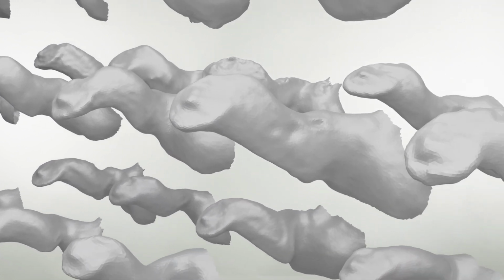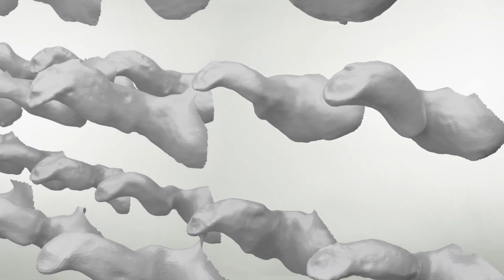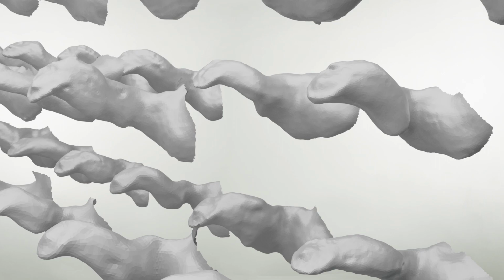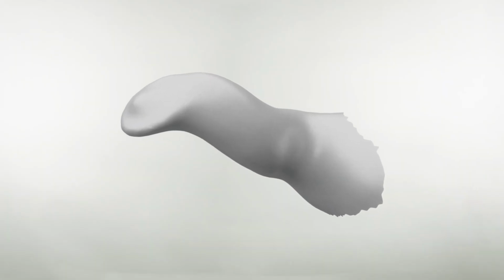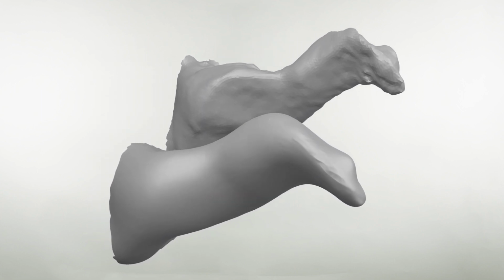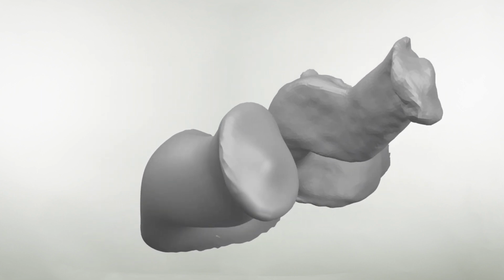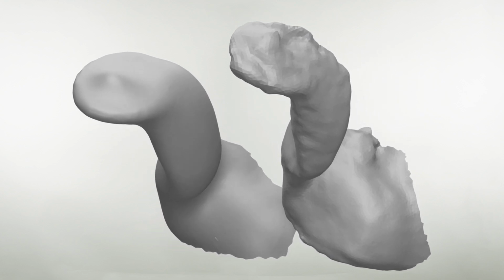While the overall shape of the subjects' ear canals was generally similar, the variability of detail between the subjects was significant. Geometry averaging using the image registration method was used to determine the mean profile along the length of the canal, resulting in an average 3D model used as the basis of an ear canal design. Here, the geometric average is compared to one of the measured subjects. As you can see, the average retains the key characteristics of the individual measurement, but smooths out the more random details. The second step in the process was to determine the average acoustic impedance.